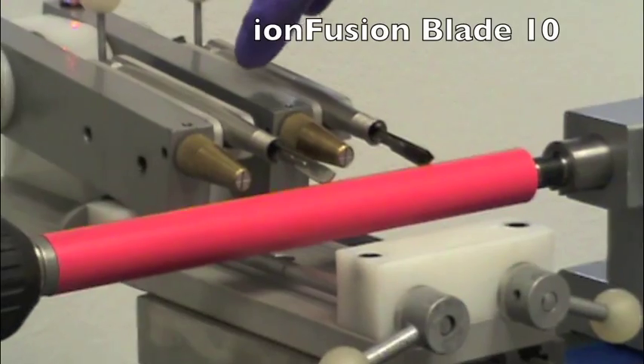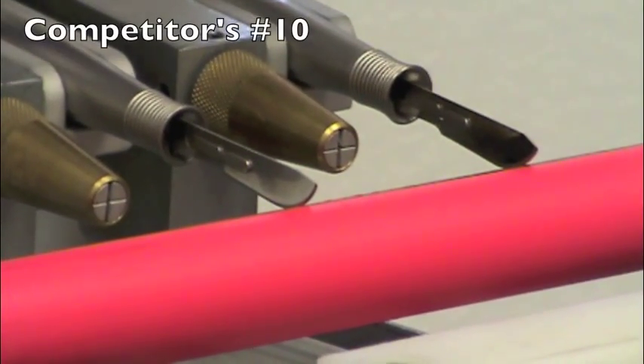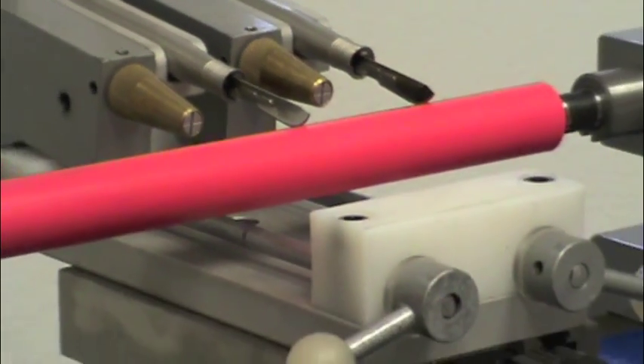On the right is Ion Fusion number 10 scalpel blade. On the left is our leading competitor's number 10 scalpel blade. I will now start the test.